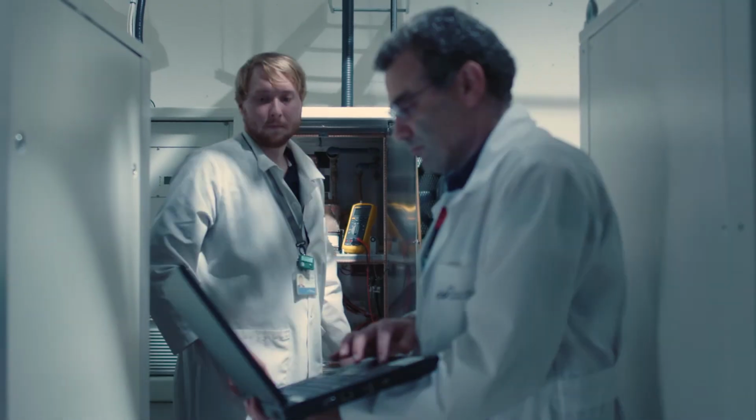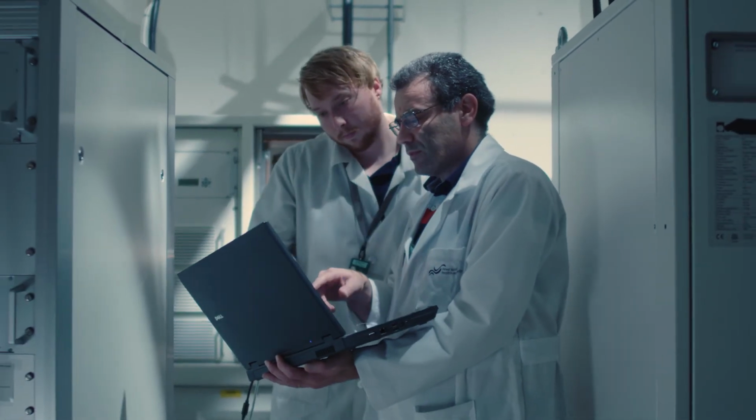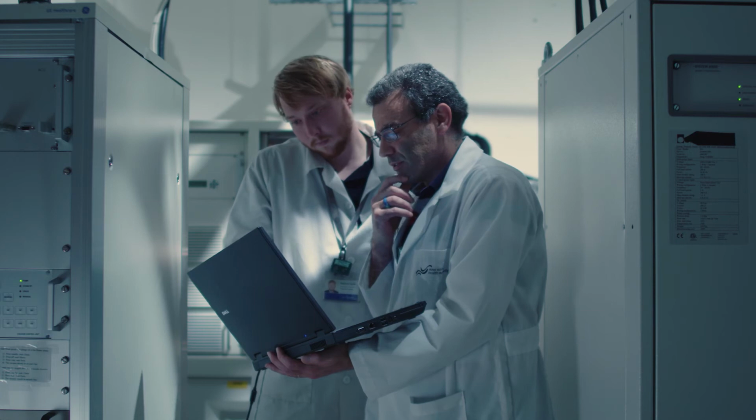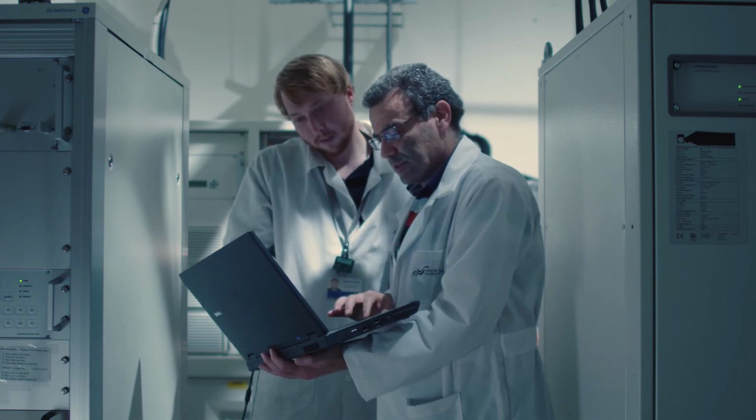Then they have to make sure that it's safe. So they do quality control on it. They do a whole bunch of tests to make sure that it's okay and that it's good to inject into the patient. So that's going on starting probably around 5 in the morning. The folks in the PET suite, so the technologists who actually run the scans and take the pictures, they'll be in around 7:30 to turn on the scanner, make sure that it's running properly. They do some quality control checks on that.